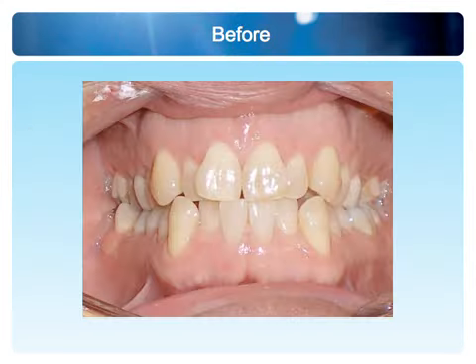Let's take a look at Robert. When we look into the mouth, we can see buccolingual inclination from the anterior view. When you see the posterior segment leaning in this far, you have a poor occlusion. This is a dramatic occlusion because the teeth are leaning in so far. You could not possibly have them upright enough that the buccolingual cusps will touch a ruler laid across the flat part of those molars. And so by looking at an occlusion like this, you know that this arch is way too narrow. You have improper arch form and improper arch width without even looking at the individual arches yet.